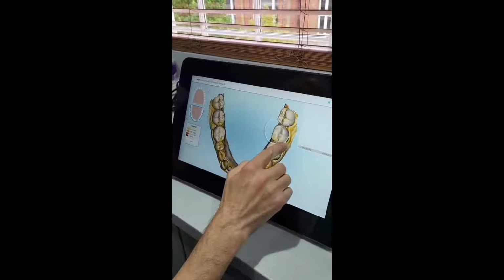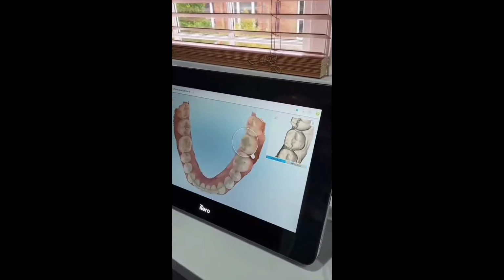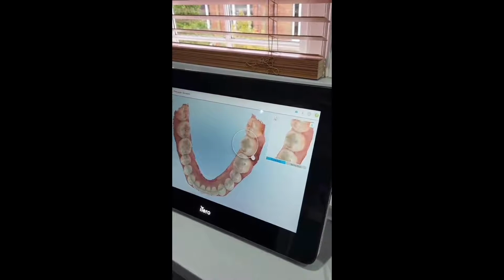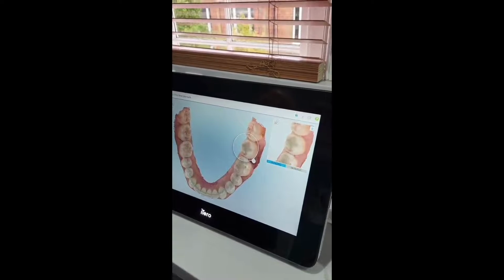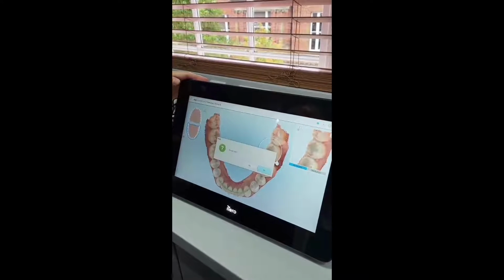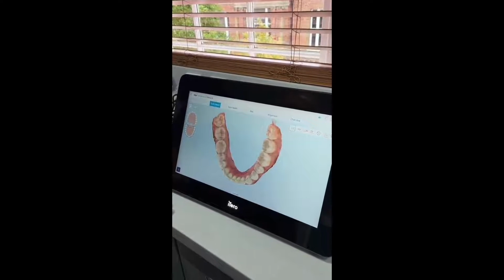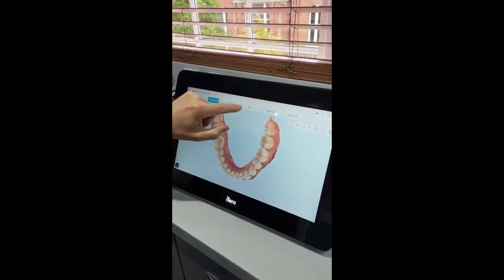We wanted to look at that fill in there, and again you can see it in the real image. See if there's any difference. Okay, you can take screenshots of these things as well, by the way. Always a risk, isn't there? There's too many tools on here, but okay, we've gone from tooth health to gum health.